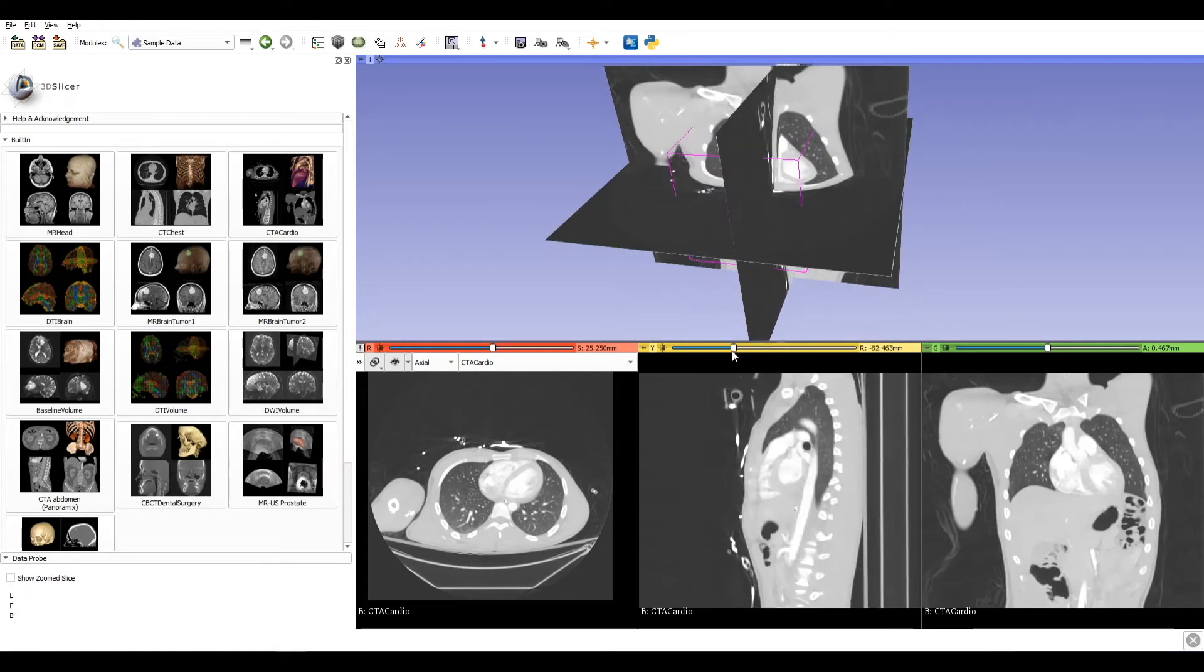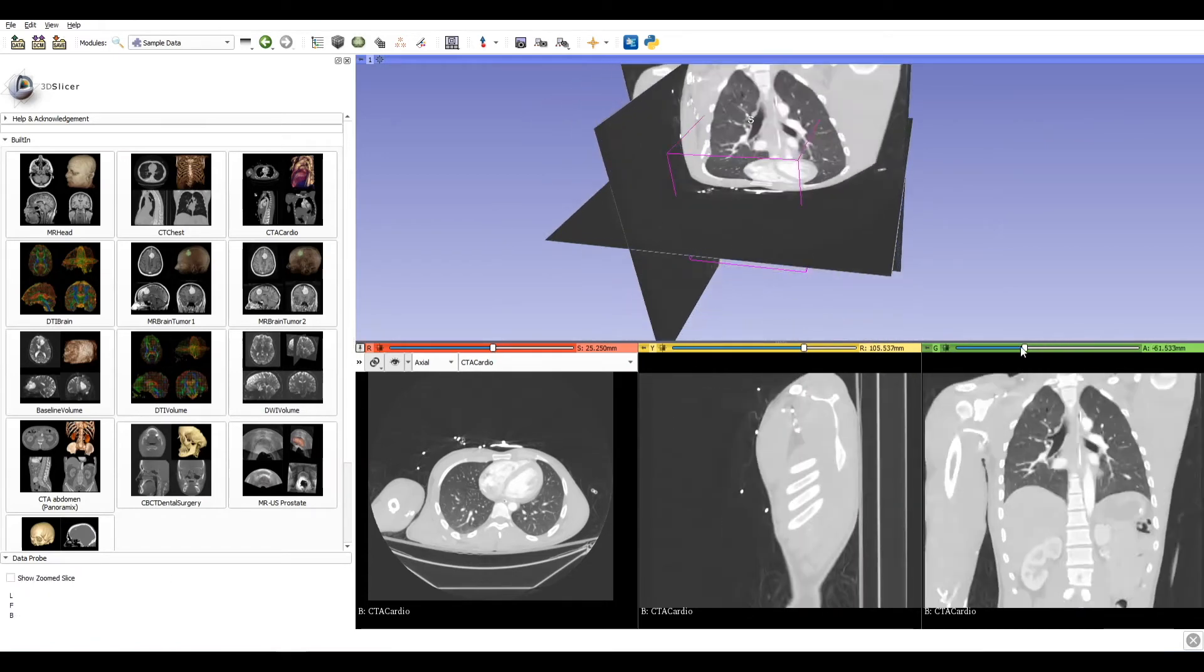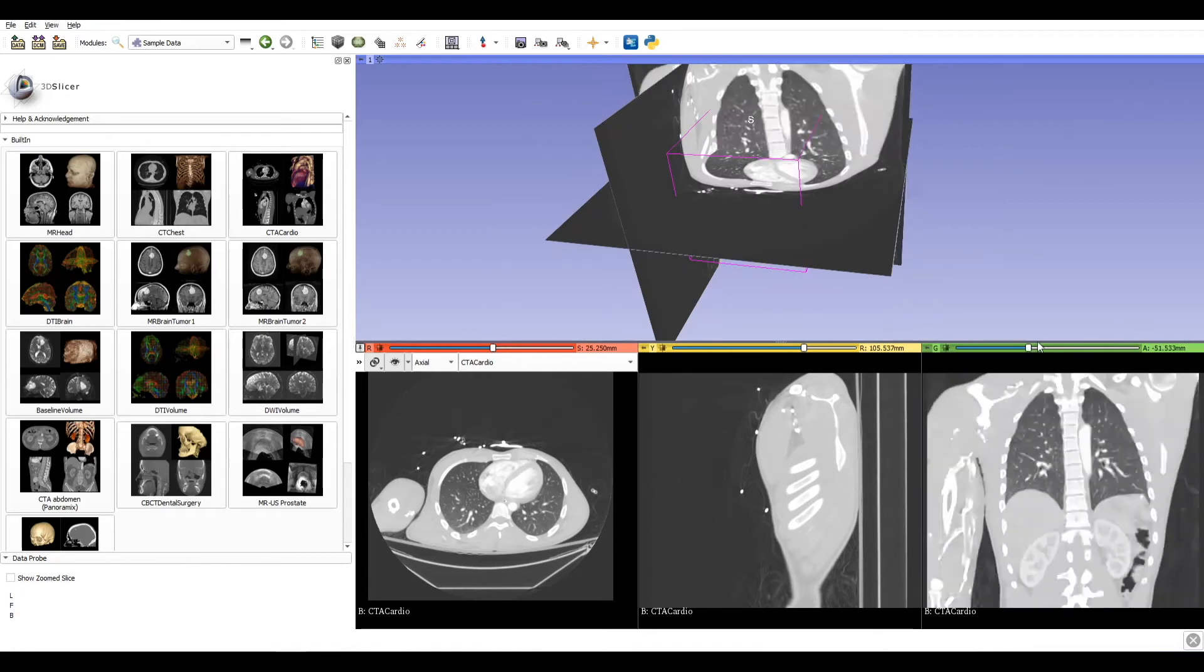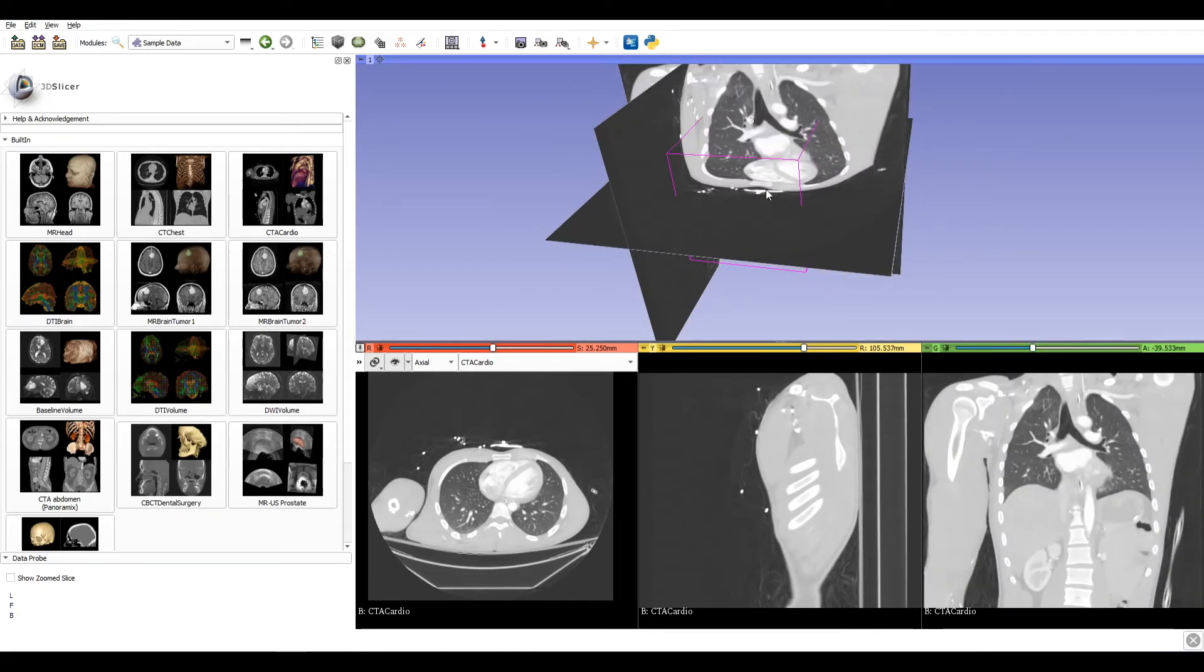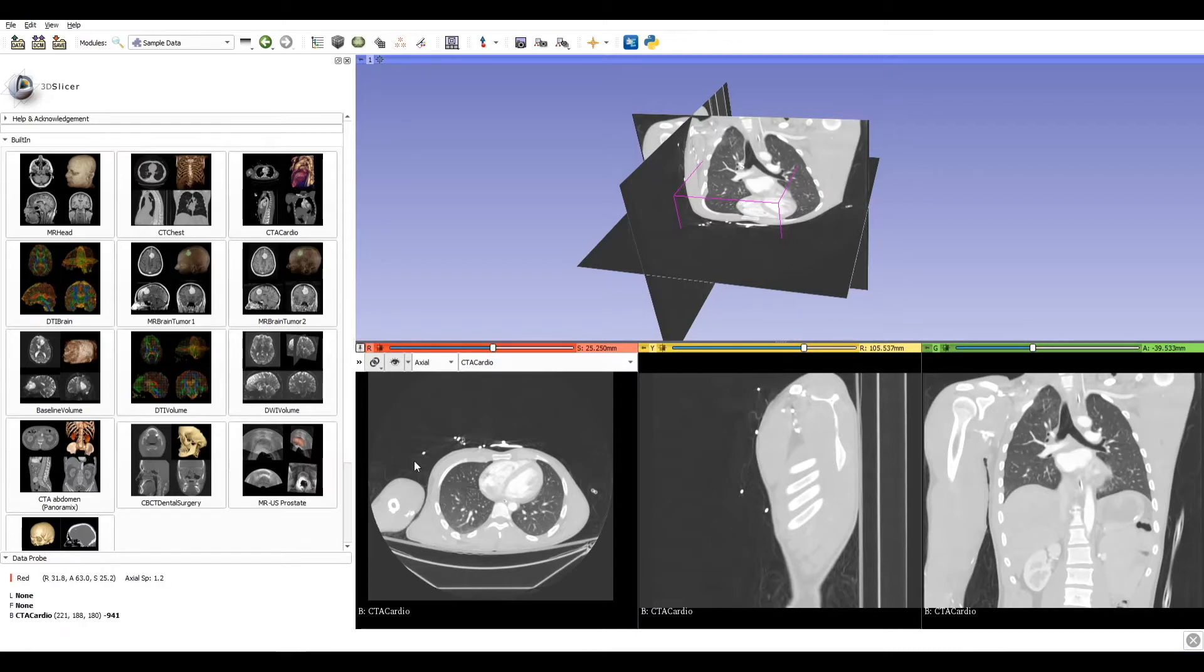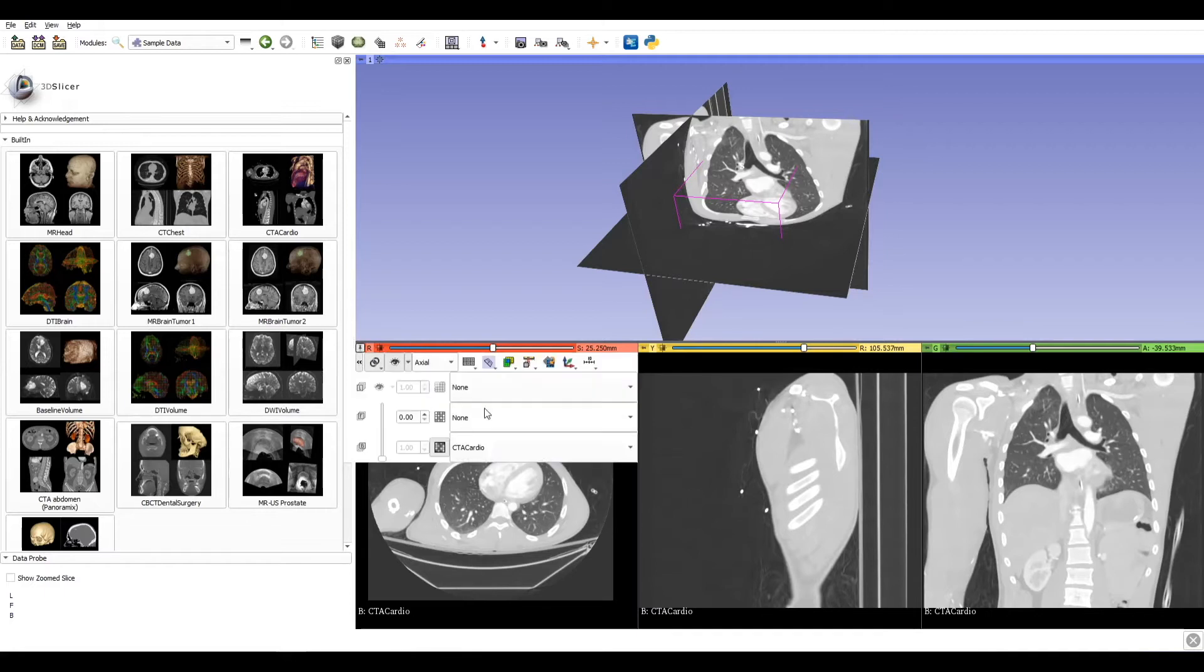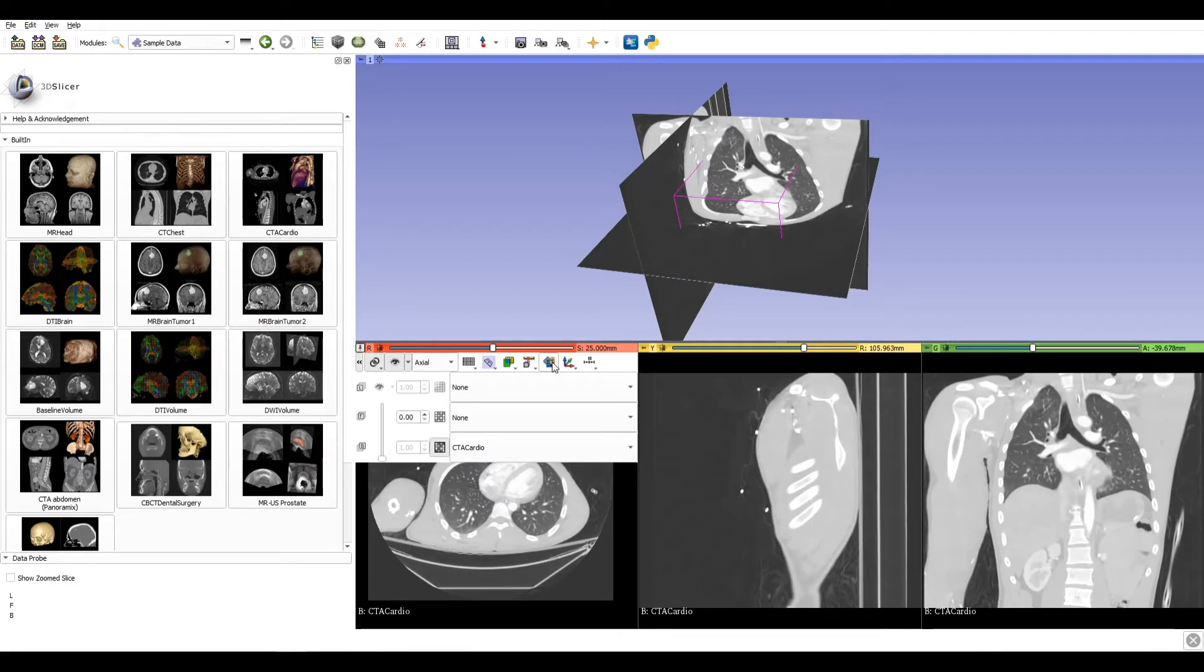We can scroll through the slice and it's real time updated in the 3D view. An important thing to do before we start working on our data is to align the slice to the plane. Click on this button with two little arrows and select rotate to volume plane. Now we are sure that all the slices are aligned with the plane.